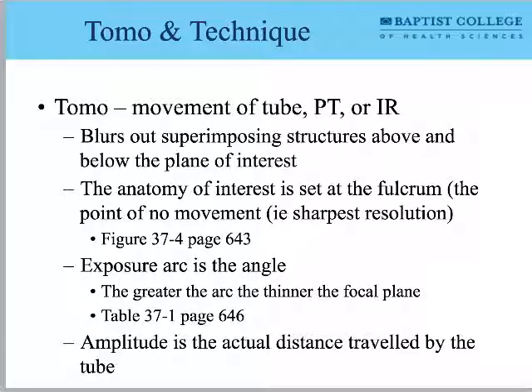What does lossy mean? I see it in the textbook, and I asked my tech the other day why it was on her picture. Like, right at the bottom, it says lossy. Lossy on her paycheck? No, on our picture, on our image. Oh, on the picture. Oh, lossy means that the image is not as high resolution as what was actually captured. So it's how it's archived. It's archived in a lossy way, and if you wait, it will gain more resolution. Digital imaging. We will talk about it. Good question, though, but not necessarily related to this.